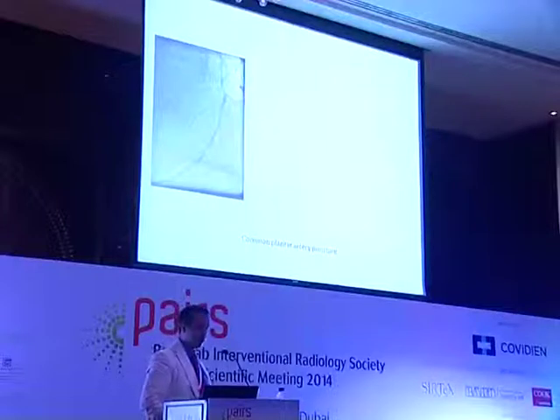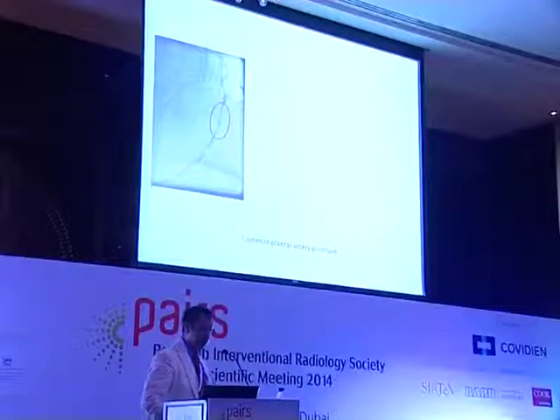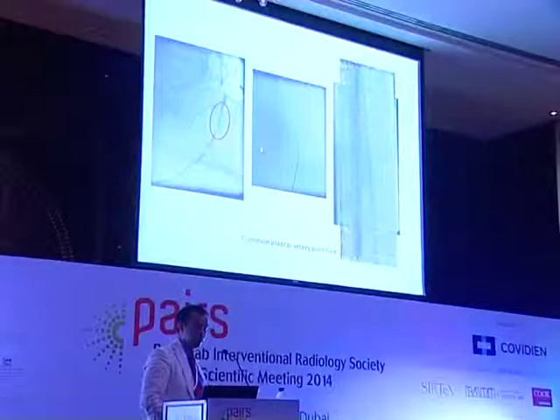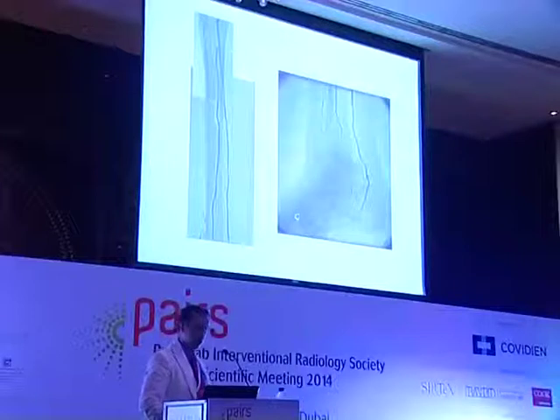common plantar artery at the level just... Time out, doctor. Yes, I'm near to finish. So we puncture and go for a retrograde recanalization, snare the wire, and the final result with this posterior tibial artery patent.